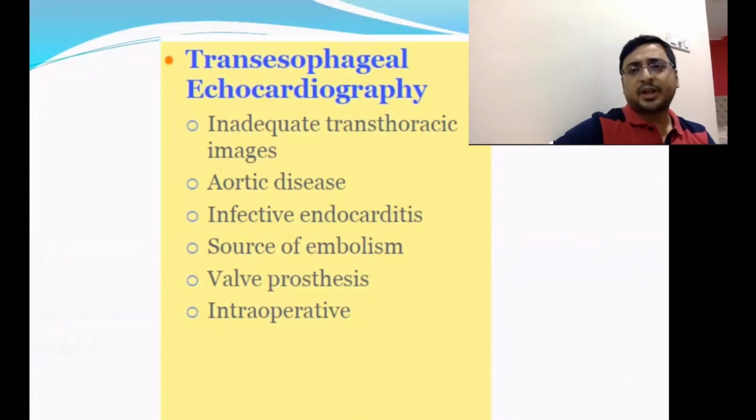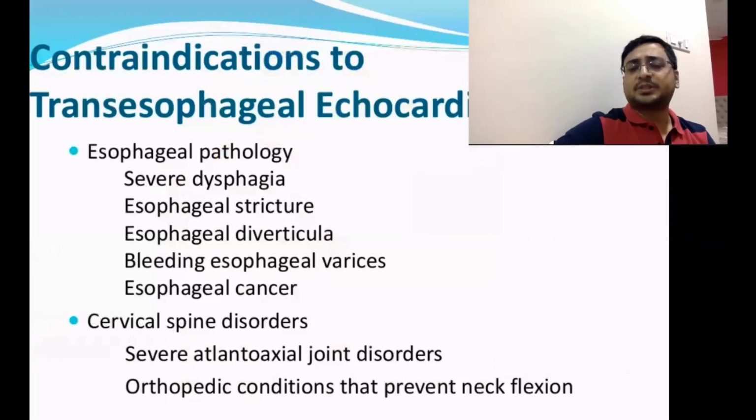Apart from that, we also use it during several procedures, such as closure of ASD and VSD, along with several other procedures nowadays. They are very latest and very innovative. We can use this intraoperative transesophageal echocardiogram. So this is the most important aspect of transesophageal echocardiogram.